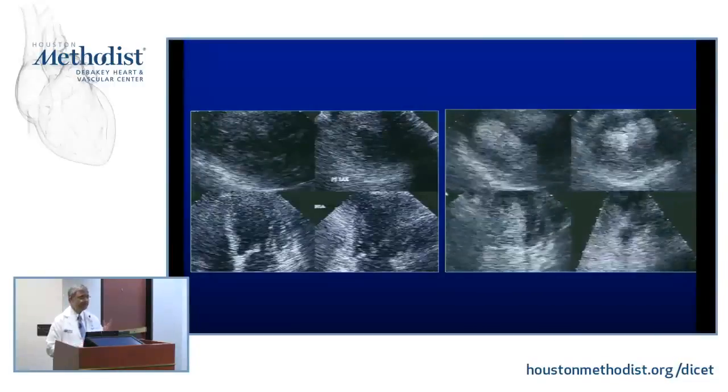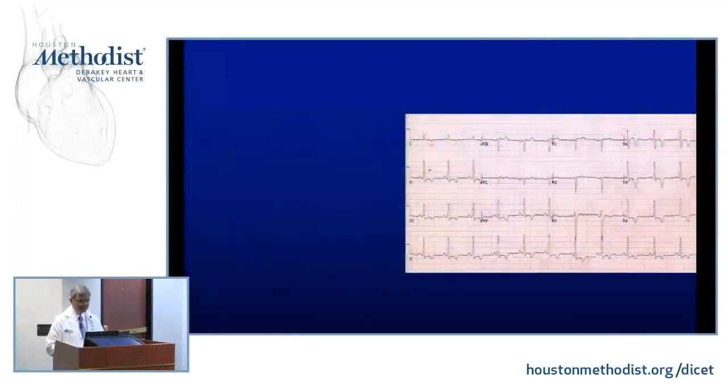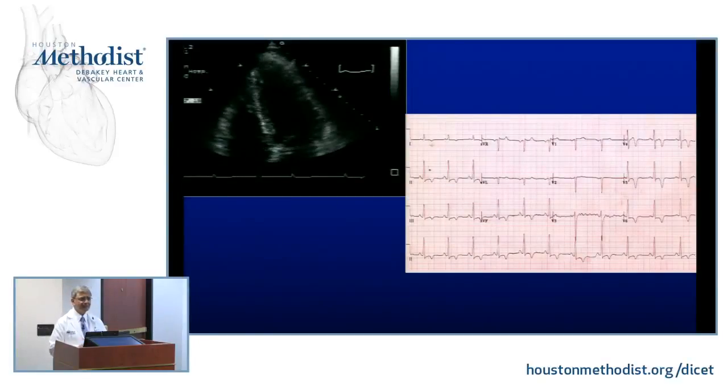It was a learning experience. This case I remember very well. Mike, I don't know if you remember that case, but this was a live case at the Washington, depressed ventricle. Suspicious of the apex, maybe an apical abnormality, and that's all I can see.